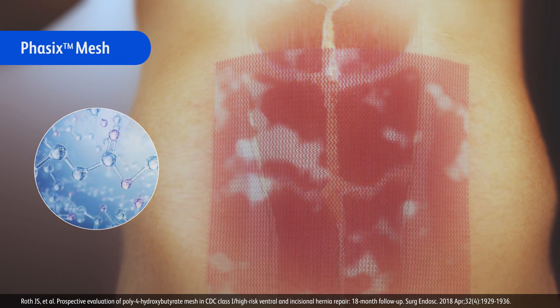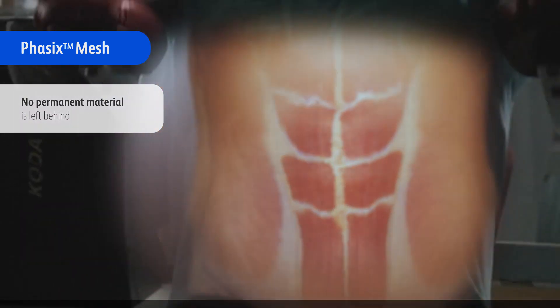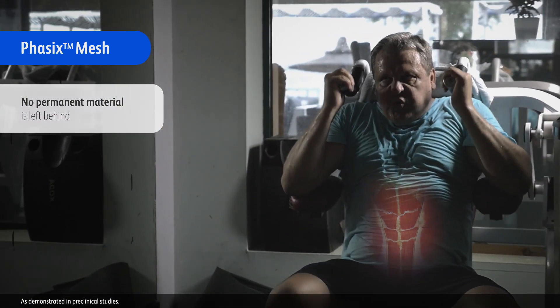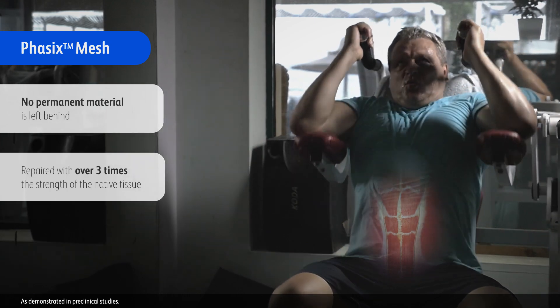Since Phasix is fully resorbed over time, no permanent material is left behind. The abdominal wall is repaired with a stronger, functional collagen with over three times the strength of the native tissue.